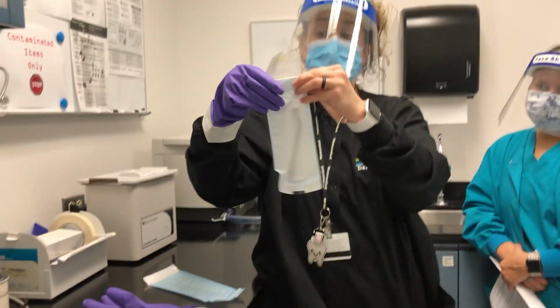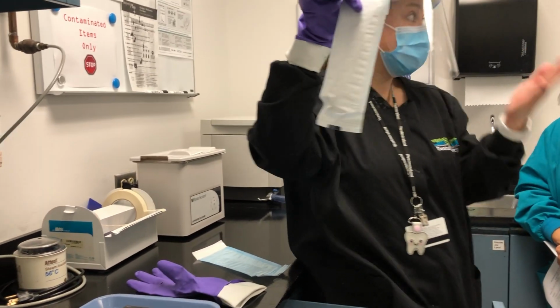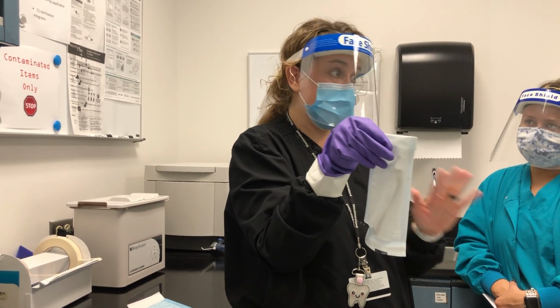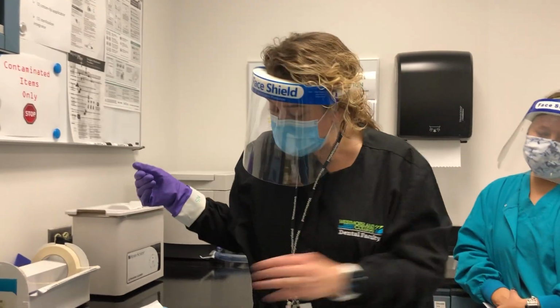Now you may have noticed I touched the bag with this purple glove. You might all be saying, oh my gosh, she's touching it. But once it's out, it's okay because this is going to be sterilized. So we're going to end up with a nice, clean, sterilized package regardless, okay? So we can lay that down then. And then we're going to do one more.